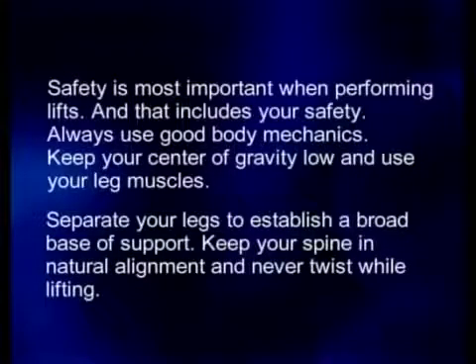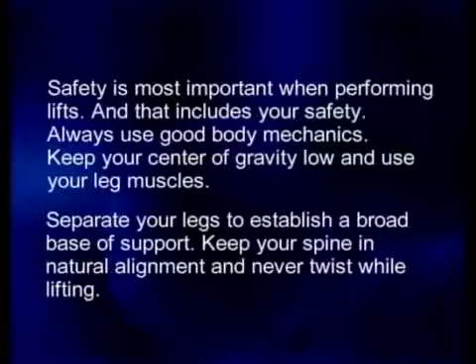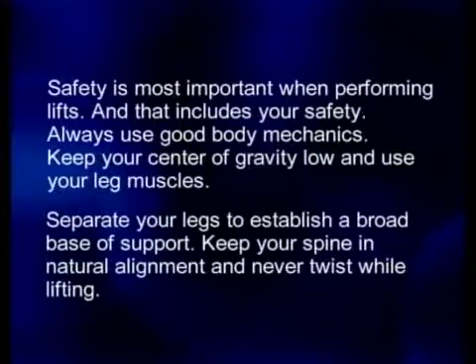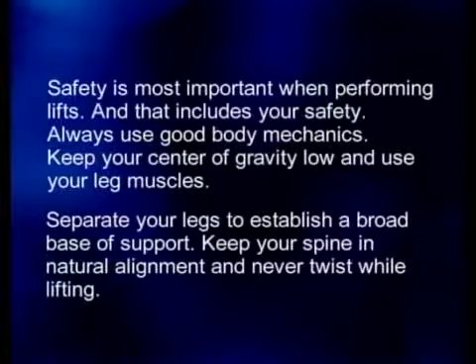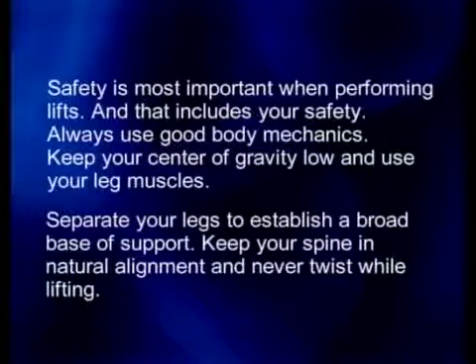Safety is most important when performing lifts, and that includes your safety. Always use good body mechanics. Keep your center of gravity low and use your leg muscles. Separate your legs to establish a broad base of support. Keep your spine in natural alignment and never twist while lifting.